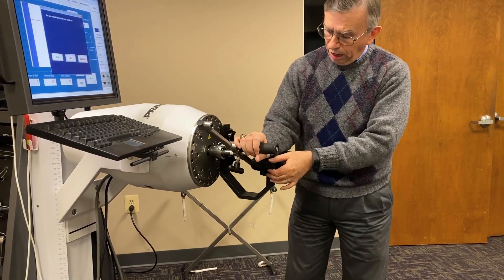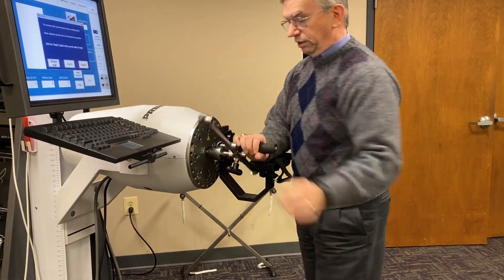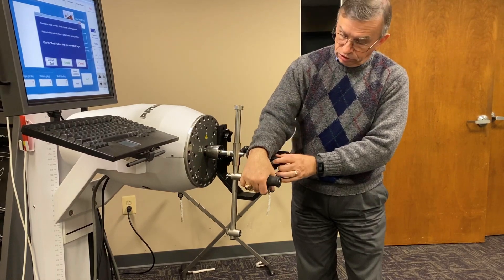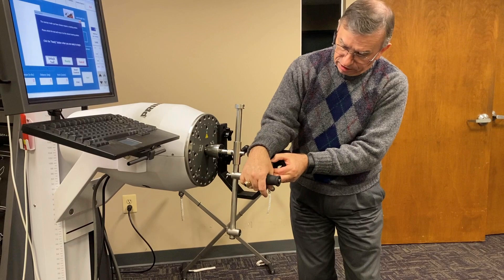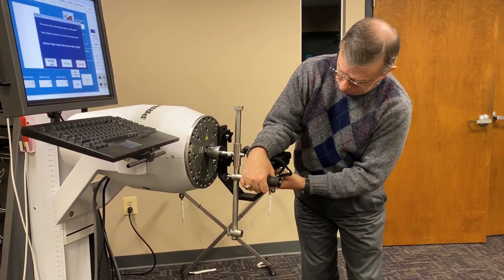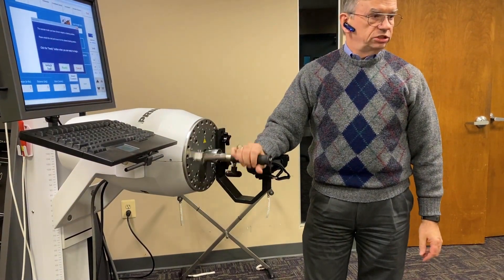To start, I want to make sure that when I unlock and I've got no resistance, I want to make sure the person got full flexion. If they can't, that means I've got to move this pad back a little bit so that I get full range of motion, and then I'm going to tighten those two knobs underneath so it's going to hold in that position.